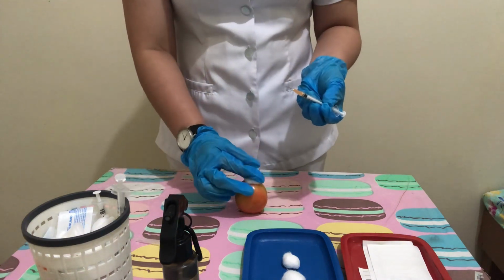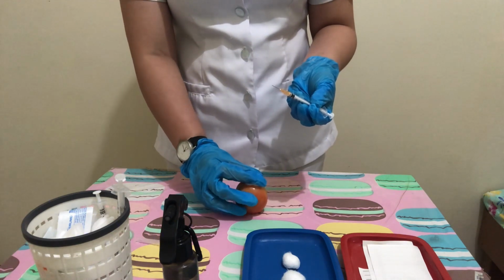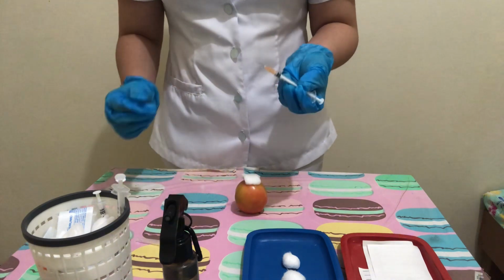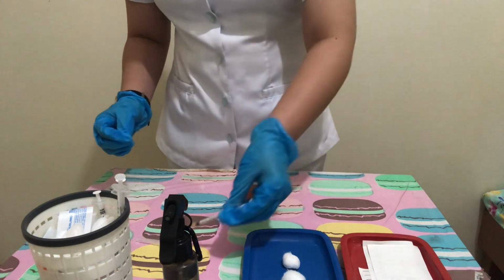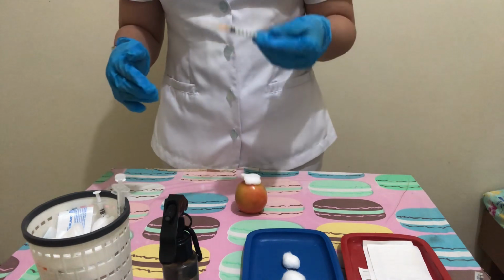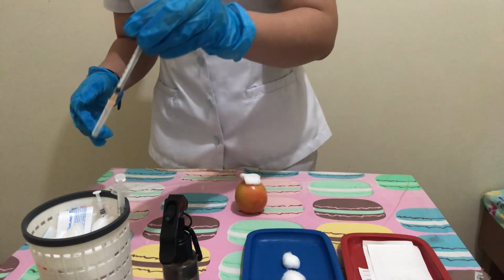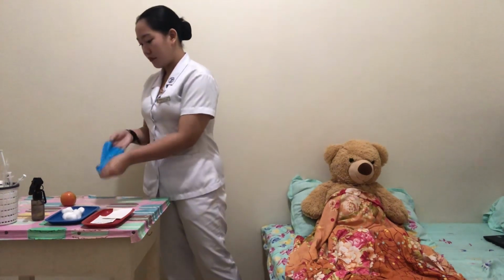Now place the gauze or swab over the injection site, applying a gentle pressure but not massaging the area. So if bleeding occurs, apply pressure with a dry sterile gauze until it stops. So this time, activate the needle safety device or discard the uncapped needle and attach the syringe into the proper setup. After that, remove and discard gloves and perform hand hygiene. Then place the patient in a comfortable position and document the procedure.